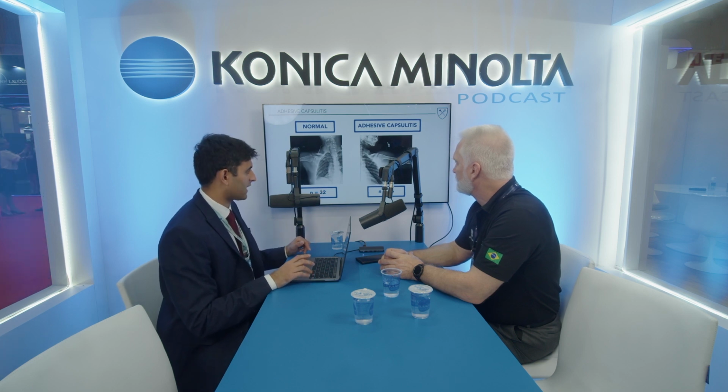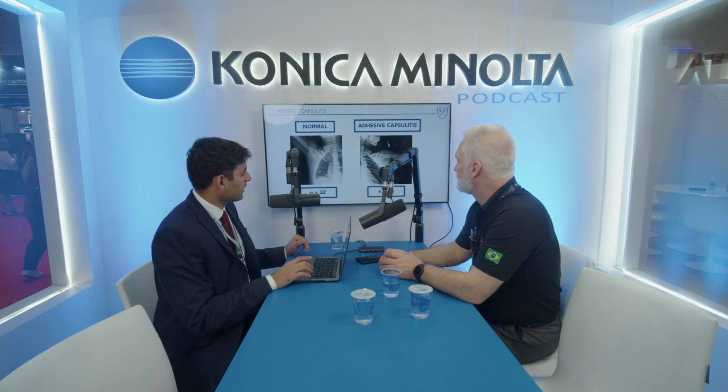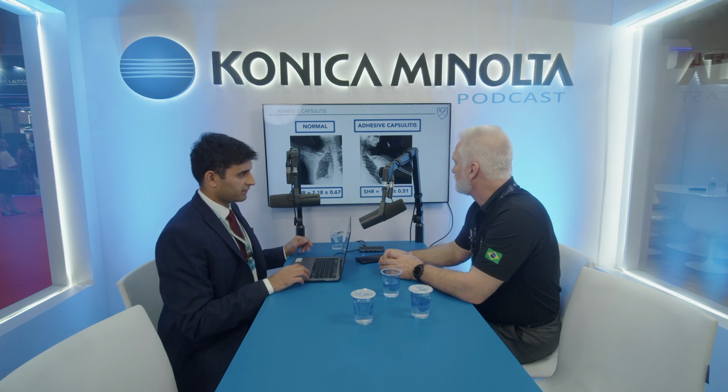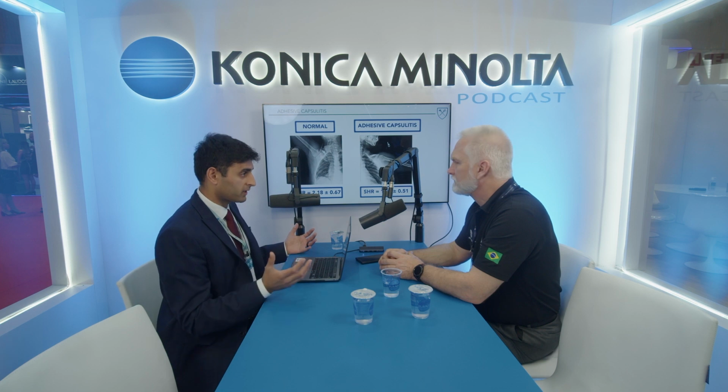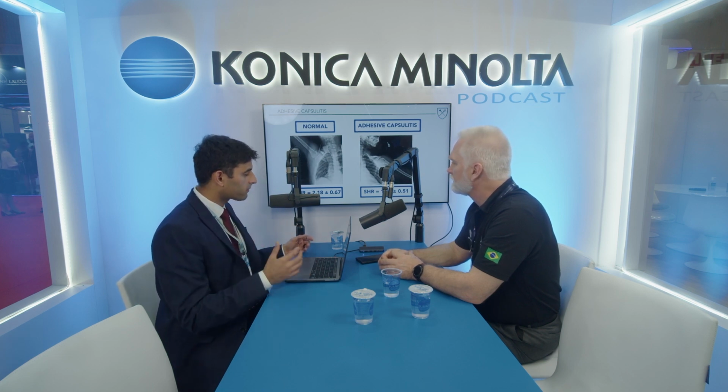I think that's fascinating. So when we're taking various cohorts of these patients, we found that the SHR was also very different when examining the dynamic imaging. Again, helping us make those interesting diagnostic decisions, hopefully diagnosing patients earlier so that we can get them back to motion earlier as well.